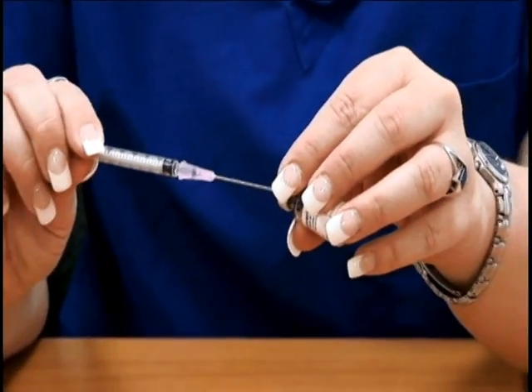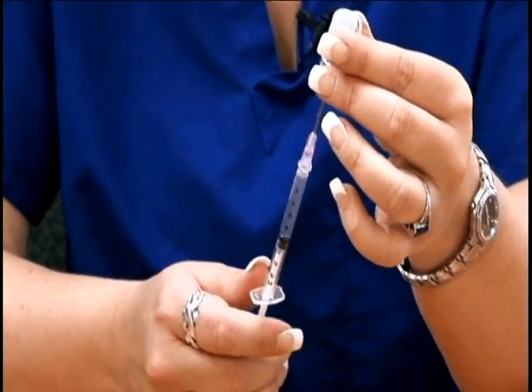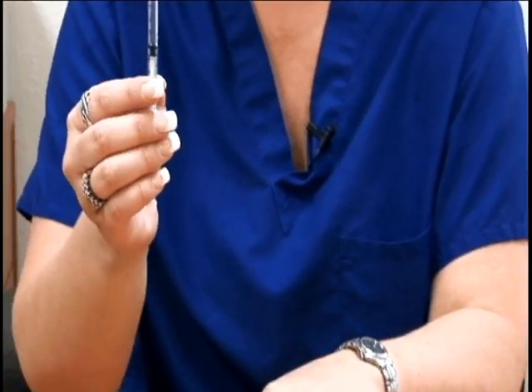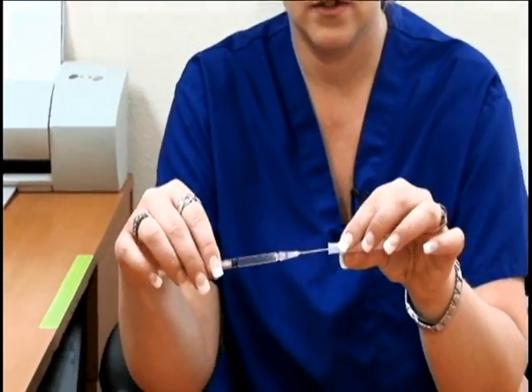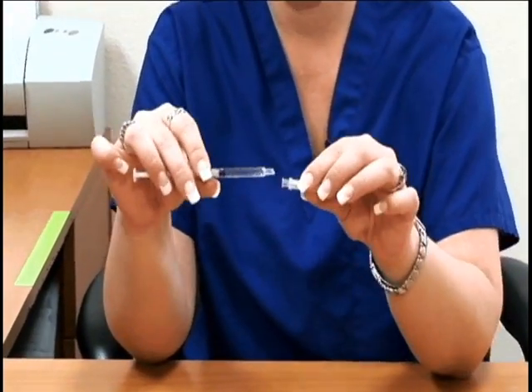Inject the needle back into the vial of medication and withdraw all of the medication. Once you've withdrawn all of the medication from the vial, you can now take off the 18 gauge needle and apply the smaller 27 gauge needle.